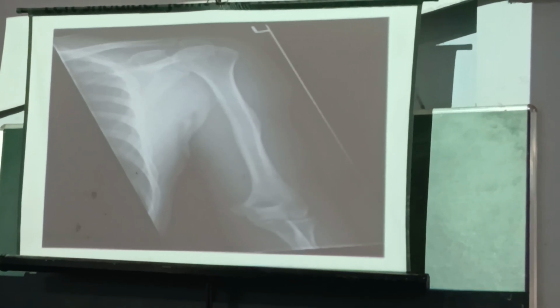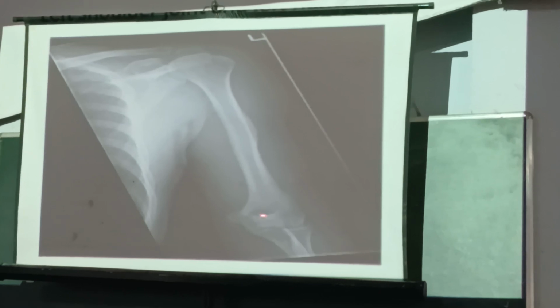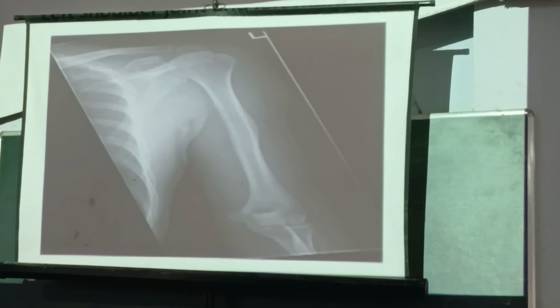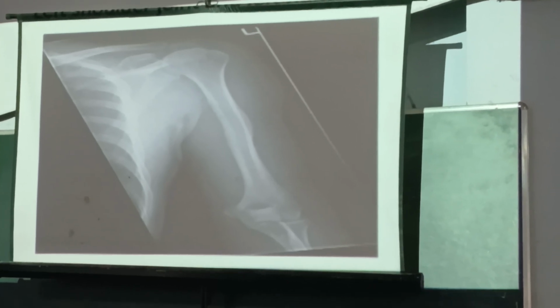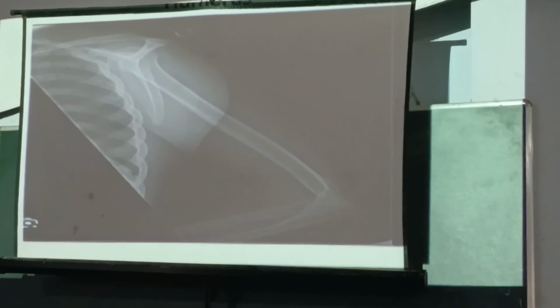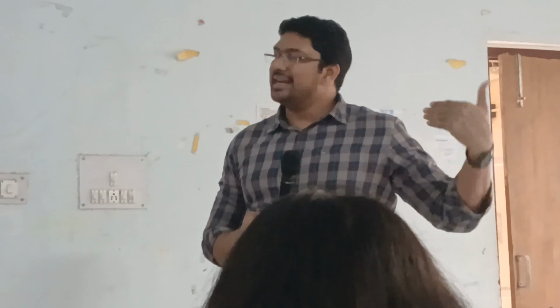So to understand that it is the anterior-posterior view, you can see the olecranon fossa and the anterior or posterior aspects of the upper end of the ulna and upper end of the radius. But if you take the lateral view, the patient will be keeping the hand in this manner. If taking the left-sided arm lateral view, the X-rays will be passed from backwards towards this side, all the way just like my mic over here. The arm will be focused in this manner. This is the anterior-posterior view, from anterior to posterior direction, and this is a lateral view, from the medial direction to the lateral direction.